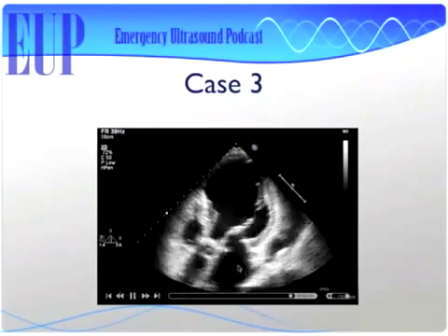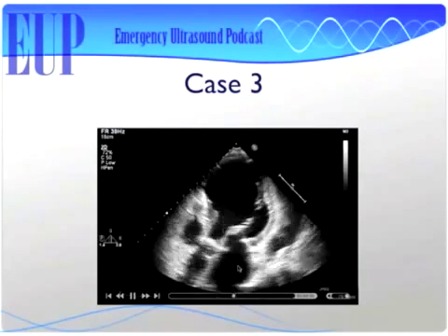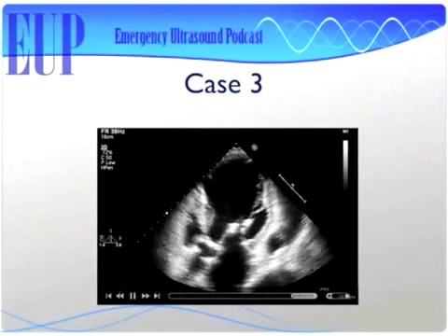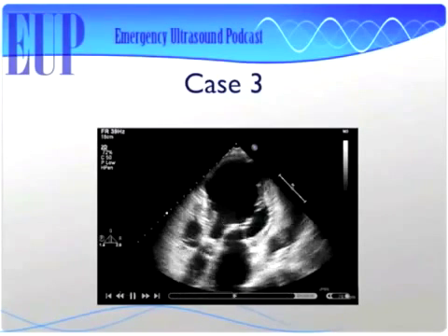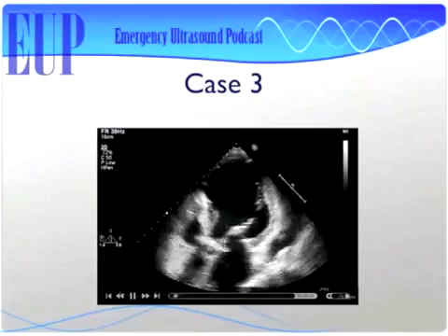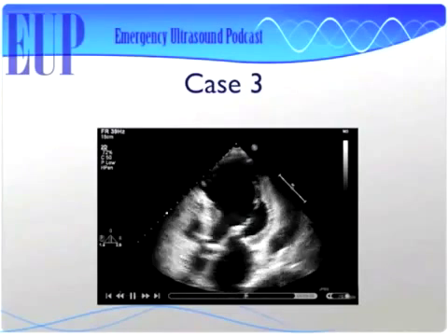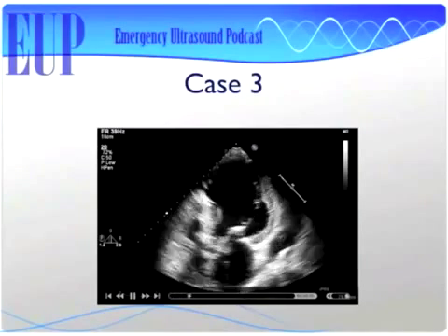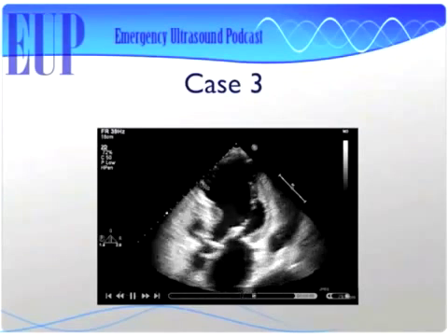Okay. And then is that your lateral or more anterior wall? Is it your lateral wall that's... You're talking about right over here? Yeah, that's not squeezing very well. Yeah, so this would actually be your inferior wall, right? That's your inferior lateral? Yeah. Good job. So this is actually the anterior septum here, right? So this is LAD distribution. So tell me, Matt, why would this part of the LAD distribution work okay, but this part would not? Because it's a more distal occlusion. Perfect. Yeah, that's an awesome answer.